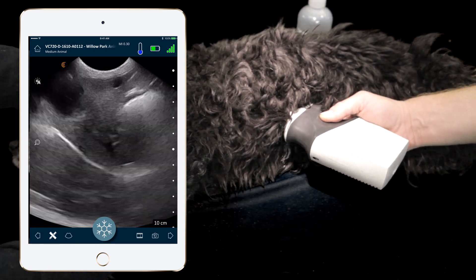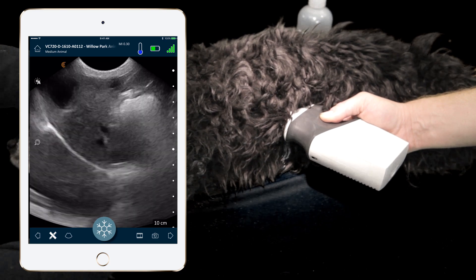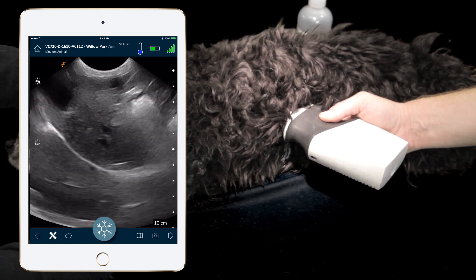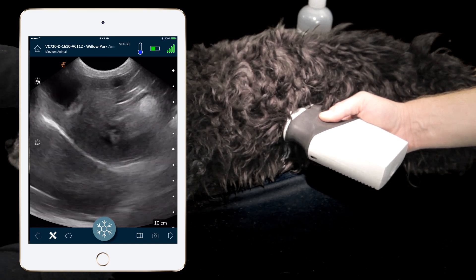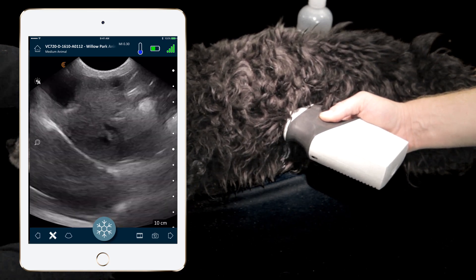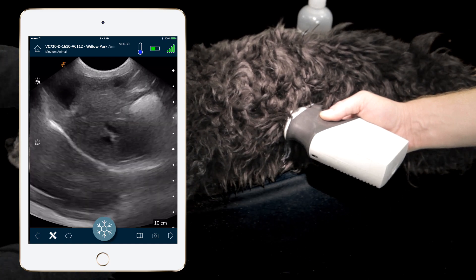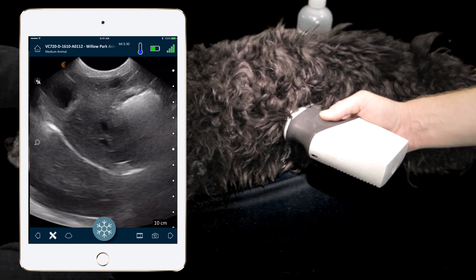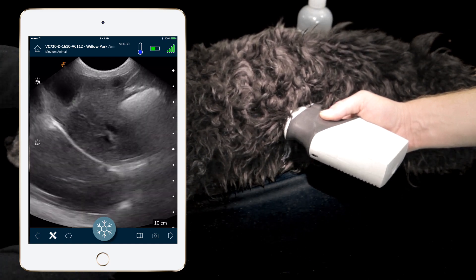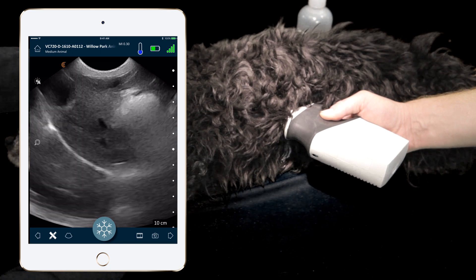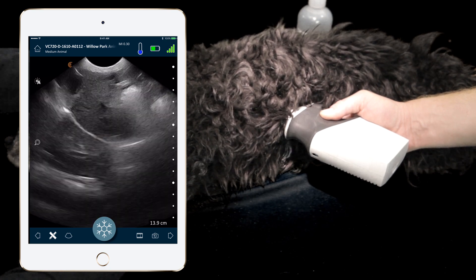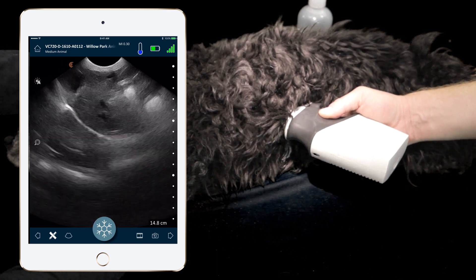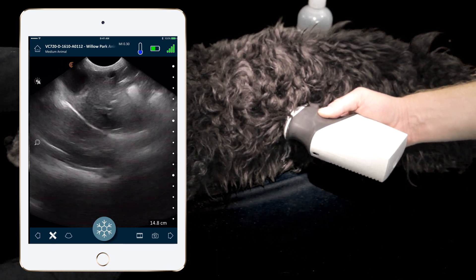To assess the area more thoroughly, we fan and move the probe around to look at both the pleural and pericardial spaces. There is no fluid at this pleural site. If we increase our depth to about 14 centimeters, we bring more of the thoracic cavity into view.